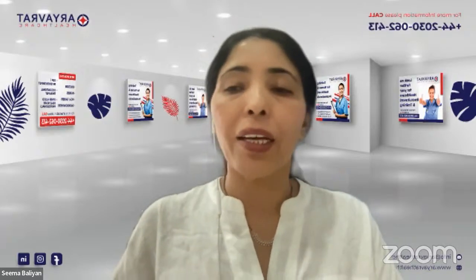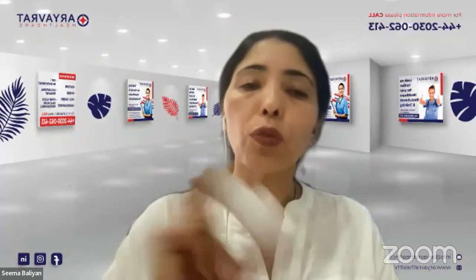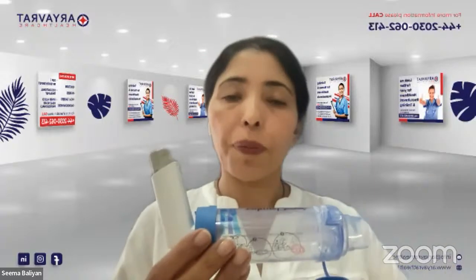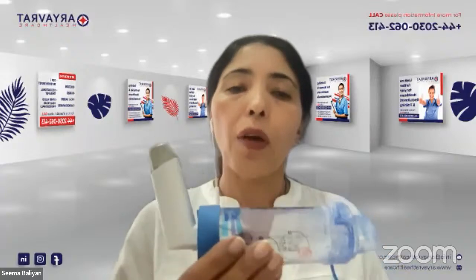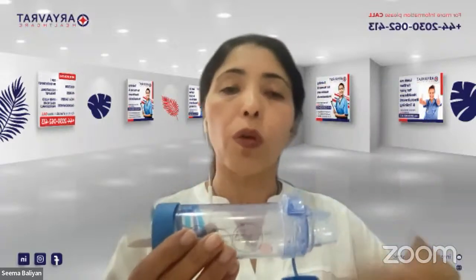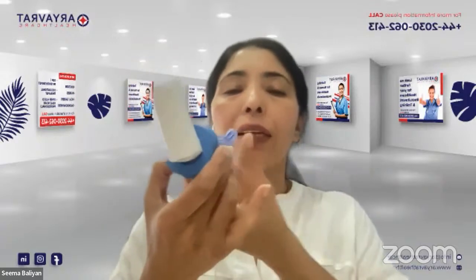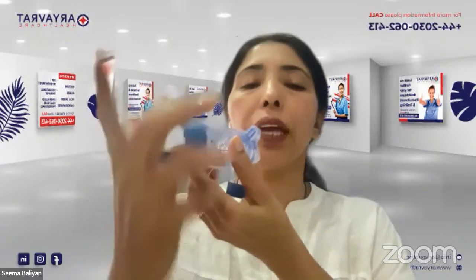Once you have confirmed that, you are going to shake the inhaler. You will shake the inhaler for 2 to 5 seconds. Once you have shaken it, you are going to insert it inside the spacer. You will check with the patient that I can see that you are sitting in an upright position and your position is fine. Now you will tell the patient to take a deep breath out, or exhale. The patient is going to take a deep breath out, make a tight grip around the mouthpiece, and the patient will need to take 5 breaths of this medicine after you have pressed the canister.